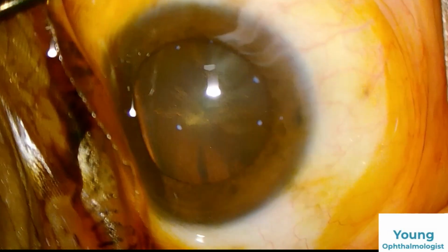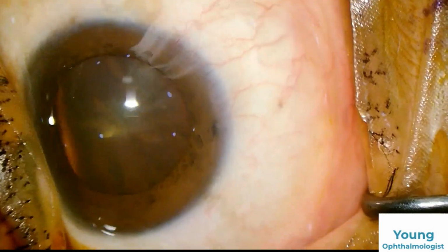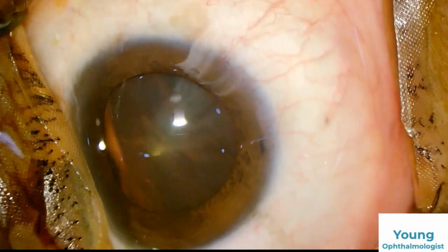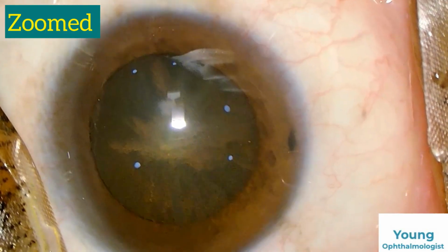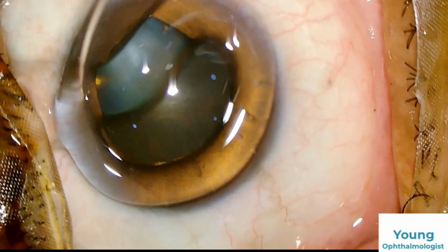Hi friends, this is a routine case. The patient is a 62-year-old male with some posterior subcapsular cataract and cortical cataract component. In this video, I will tell you the components and pearls of planning for a topical case in your first few sessions.